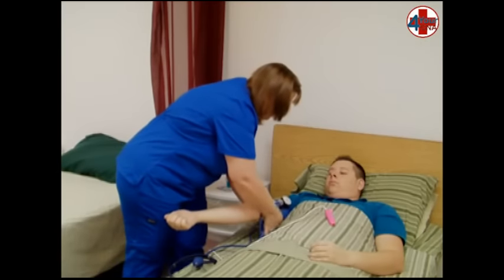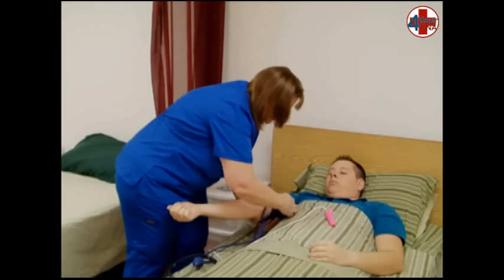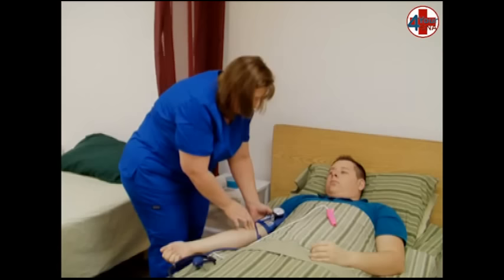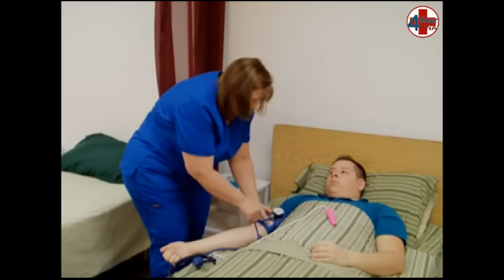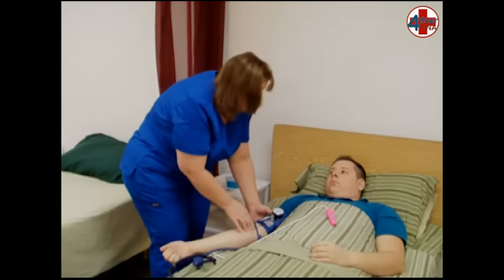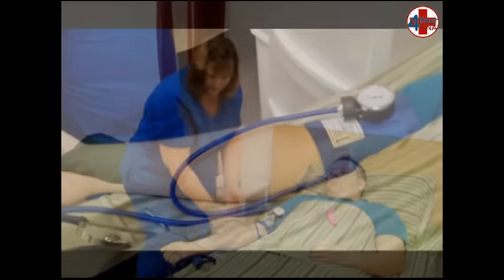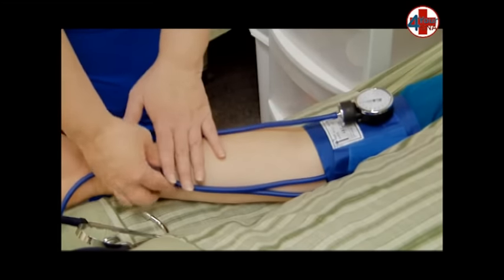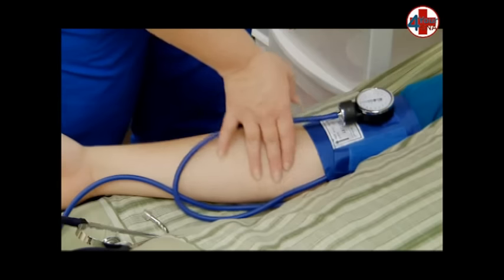Wrap the deflated cuff around the upper arm at least one inch above the fold of the elbow. The cuff will be secured with velcro as you wrap it. The gauge should be facing you. Make sure the tubing is not kinked or under the cuff, and identify the arrow that will point to the brachial artery on the lower edge of the cuff.